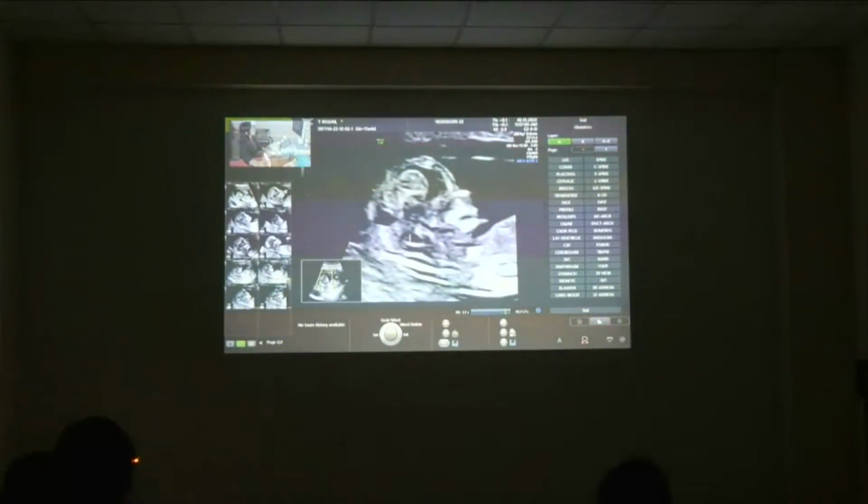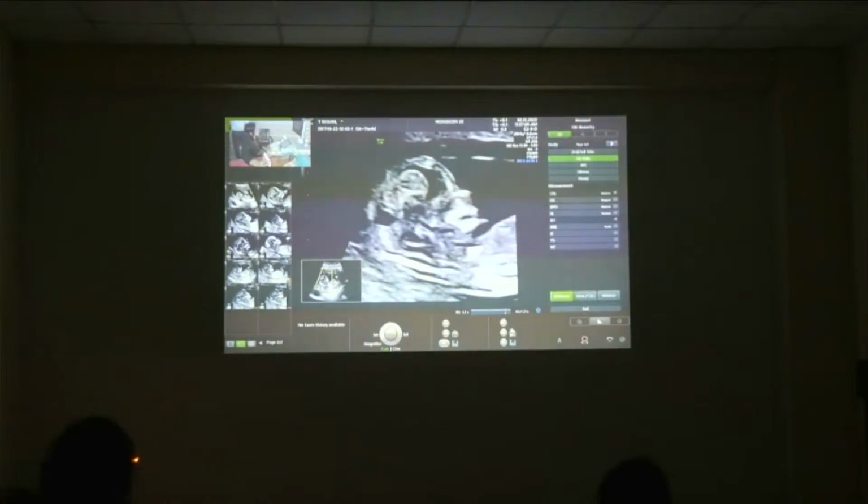because the maxilla shows the IT, the NT, and so this is the true sagittal plane, and this is the midbrain. So this is the BSOB diameter which we see. This is the brainstem, and this is the brainstem occipital diameter. So when the IT is properly seen, when the IT is intact, then this BSOB measurement is more than the thickness of the brainstem. So this ratio is less than 1.